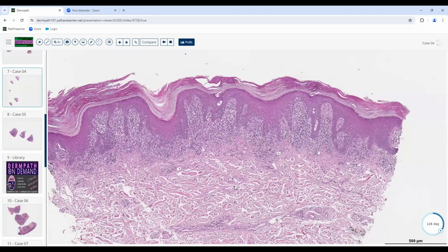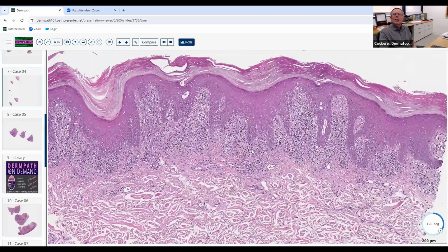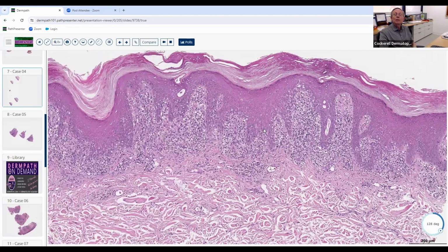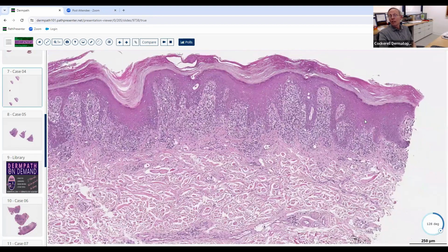Maybe also EM could give you this. I saw a couple of dyskeratotic cells, but not many, and usually EM has a more lymphocytic infiltrate. There's one you probably aren't going to think about, but at least I'm going to mention it to you. Notice that some of these cells are in the epidermis. Woringer-Kolopp disease, and there is a form of granulomatous Woringer-Kolopp where you get histiocytes in the infiltrate.